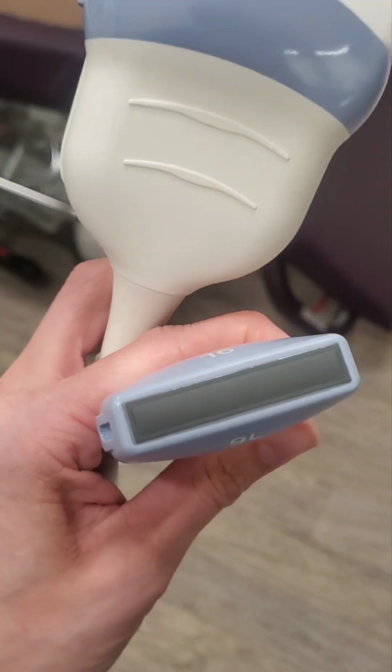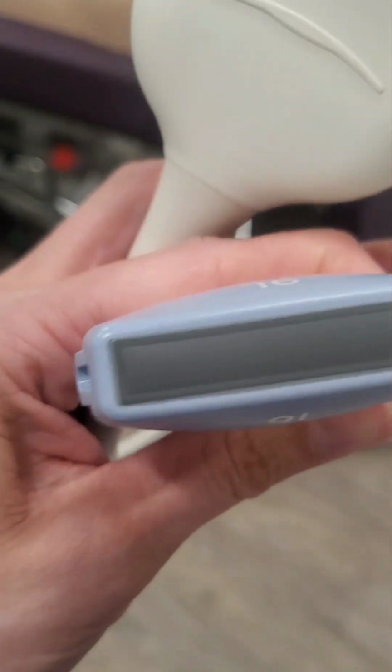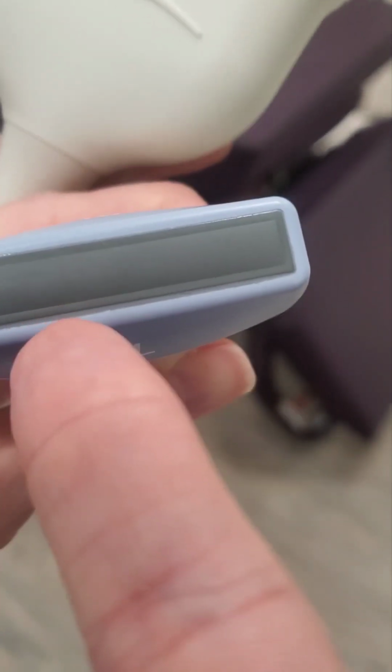So, for example, we have side to side, and then we have this height here. Okay, we have this height here on this transducer, okay?